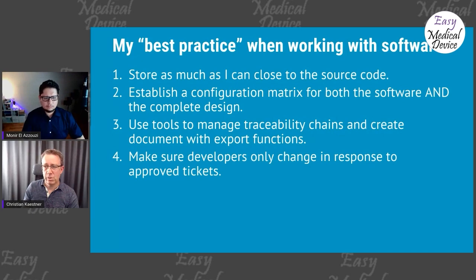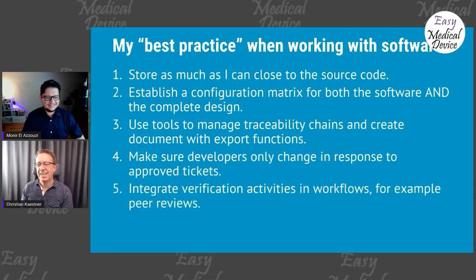Make sure developers only change the source code in response to approved tickets. I haven't talked about that, but if I work as a project manager, I never allow people to change anything in the source code unless there's a valid, approved ticket to do that. Because otherwise the shit hits the fan. Sorry for being brutal.